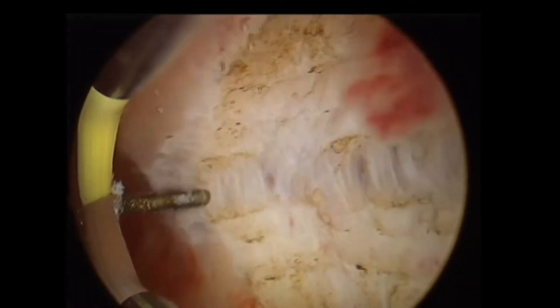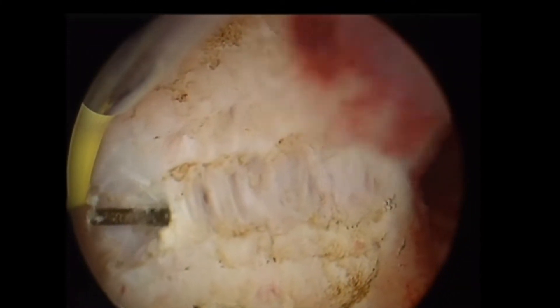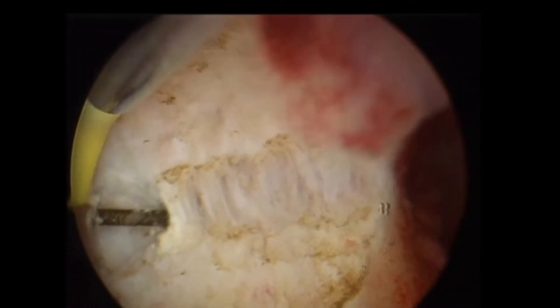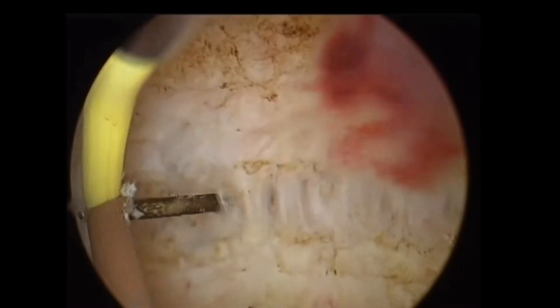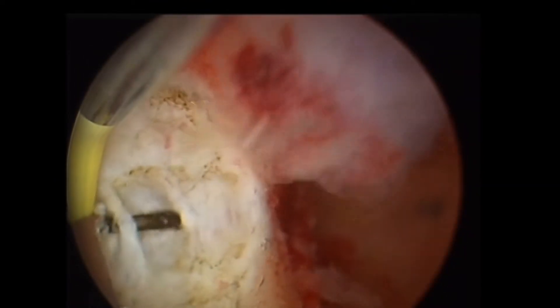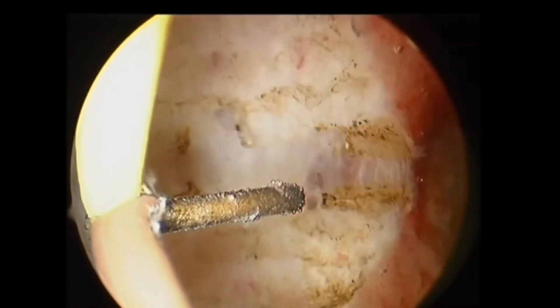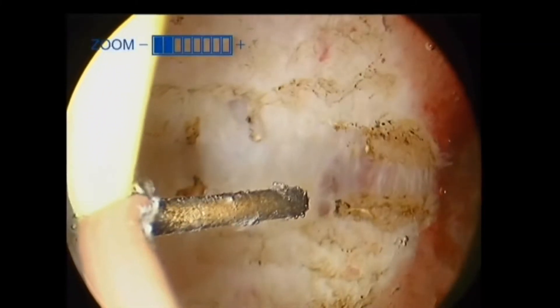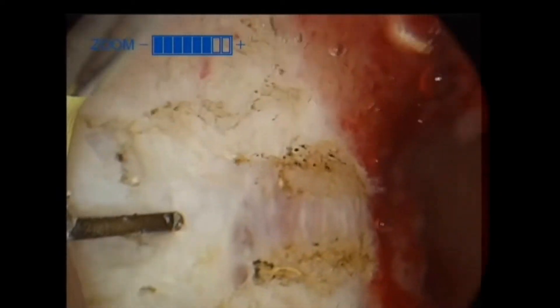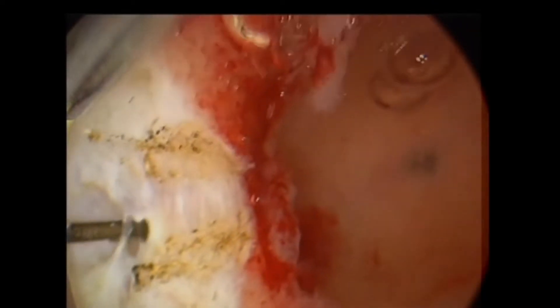It needs some patience and very gentle movement — just a few millimeters. But if you keep the resectoscope in the same place it will be turbid fluid all the time. The outflow will not work well and you get frustrated, unable to achieve a nice view to complete the surgery.